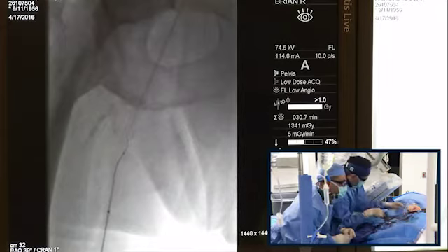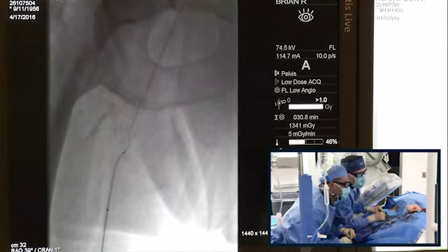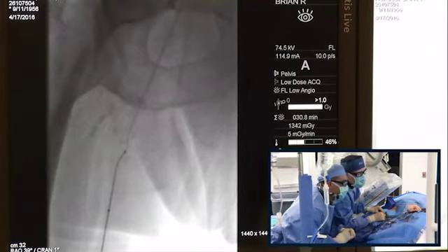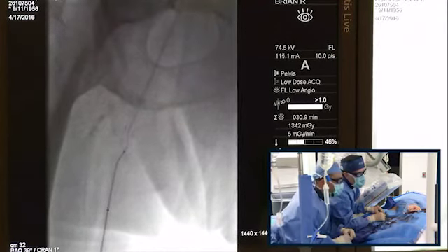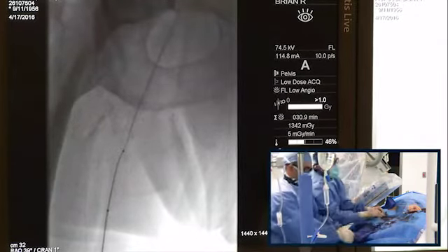If it doesn't work, I'm just going to do an angioplasty, reverse CART kind of a situation. Yeah, but it seemed that you already connected both lumina, so it's probably. I thought so too. So it's probably, but it doesn't look easy. Oh, here we go. We got it. All right, good job.